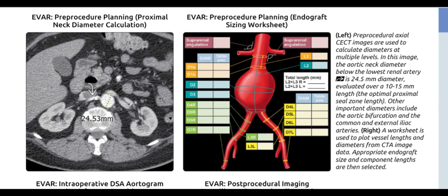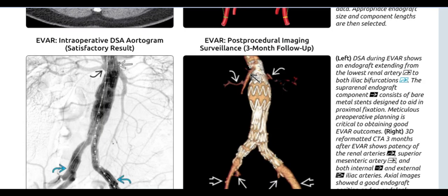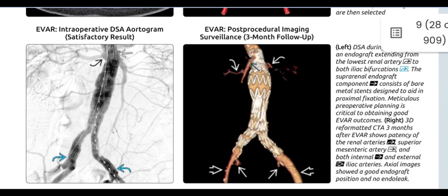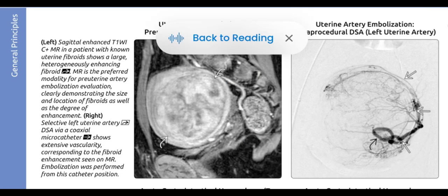Other important diameters include the aortic bifurcation and the common and external iliac arteries. A worksheet is used to plot vessel lengths and diameters from CTA image data, and appropriate endograft size and component lengths are then selected. DSA during EVAR shows an endograft extending from the lowest renal artery to both iliac bifurcations. The suprarenal endograft component consists of bare metal stents designed to aid in proximal fixation. Meticulous pre-operative planning is critical to obtaining good EVAR outcomes. 3D reformatted CTA three months after EVAR shows patency of the renal arteries, superior mesenteric artery, and both internal and external iliac arteries, with axial images showing good endograft position and no endoleak.